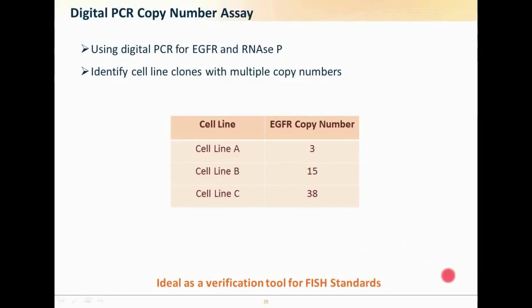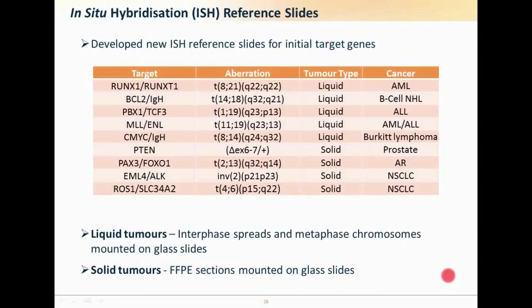applying them for FISH standards, because if you can define what's going on at the genetic level using non-FISH methods, it gives you great confidence that when you're setting things up with FISH, what you're seeing is exactly what you should be seeing. And this is a small list of where we've focused initially for our FISH slides, and the different translocations and one deletion of PTEN.